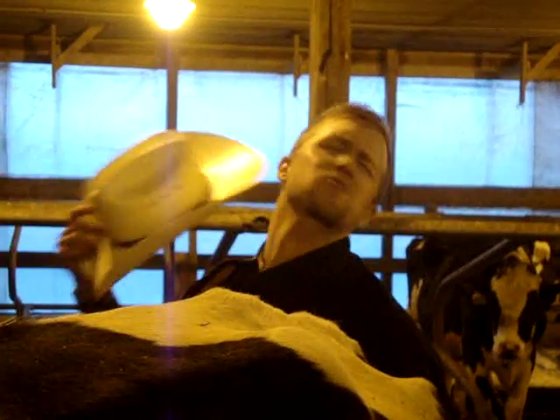This one here — oh yeah, real deep cow. She's pregnant, she's great. What about twins? They say with those machines you can tell twins a lot easier, but I like to just palpate. I think it does just the same job, and usually about 90% of the time I'm correct... about 50% of the time.